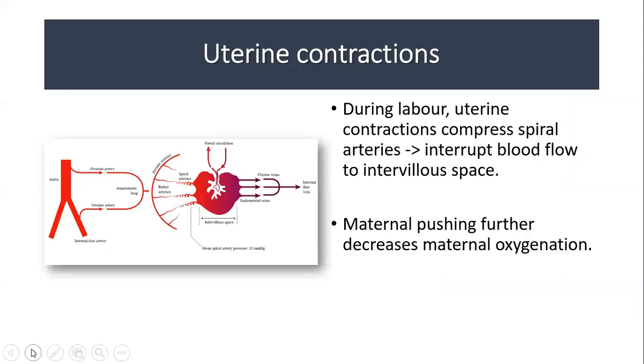So in normal labor, you have regular effective contractions causing progressive cervical dilatation that leads to the birth of the baby. Now, we're talking about uterine contractions in the context of fetal monitoring. And this is part of a whole continuous fetal monitoring interpretation series.